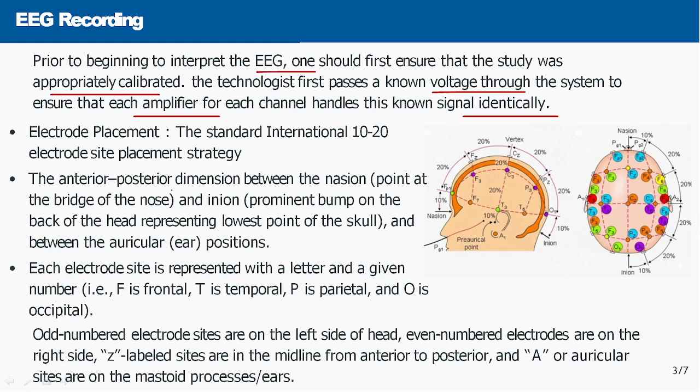A well known electrode placing system has been adopted, that is the standard international 10-20 electrode system. The 10-20 electrode system is like this.